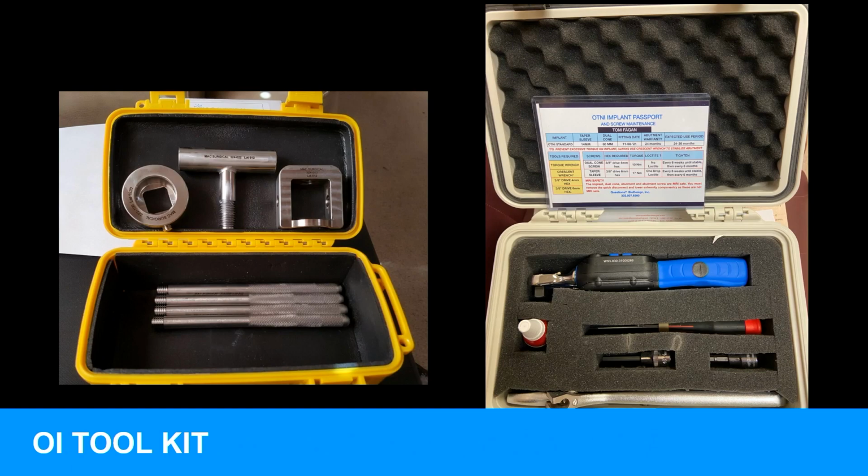Our patients leave with a toolkit. Should I be giving a patient a toolkit? I don't know. But I'm confident that they're supposed to bring that toolkit to you, and that way you have all the tools available. When you start seeing more than 2 OI patients, it might be time to purchase your own toolkit, and it's very simple.